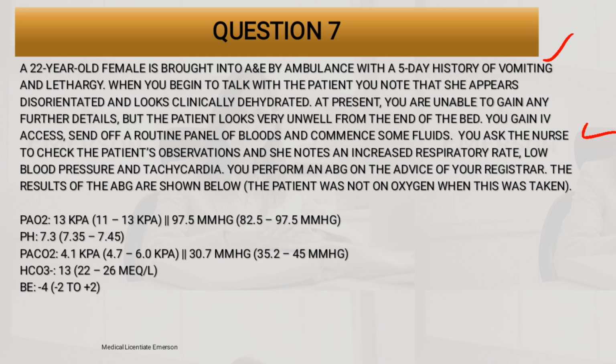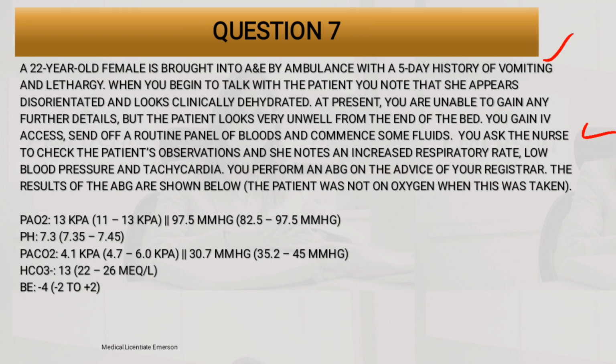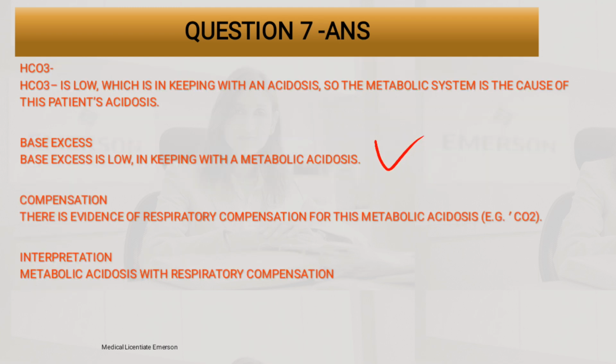So there is some form of compensation, with reduced levels of carbon dioxide. Okay, so in interpretation, there is metabolic acidosis with respiratory compensation.